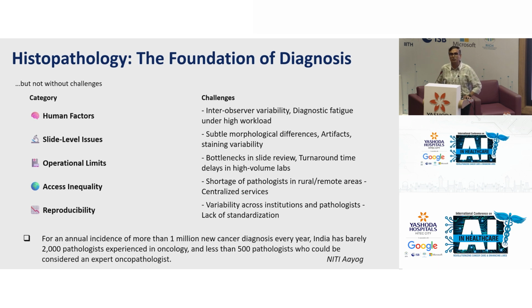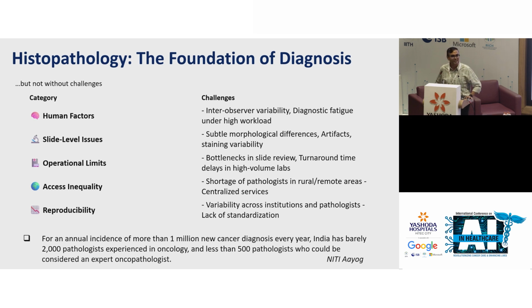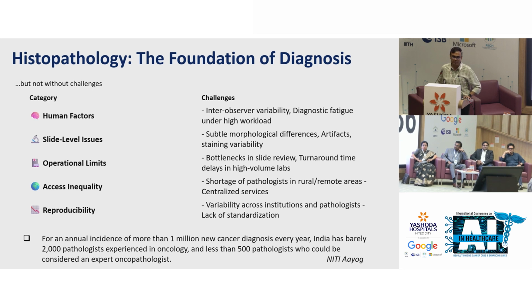There are a lot of challenges that one has to overcome in terms of the technology we are discussing today. I just asked ChatGPT to list the challenges in histopathology, and it could list some of them. Mostly it is the inter- and intra-observer variability among pathologists, as well as the shortage of pathologists in India. These are challenges in terms of accessibility, affordability, as well as quality of care, the three pillars we talk about in the context of the Indian healthcare setting, right?